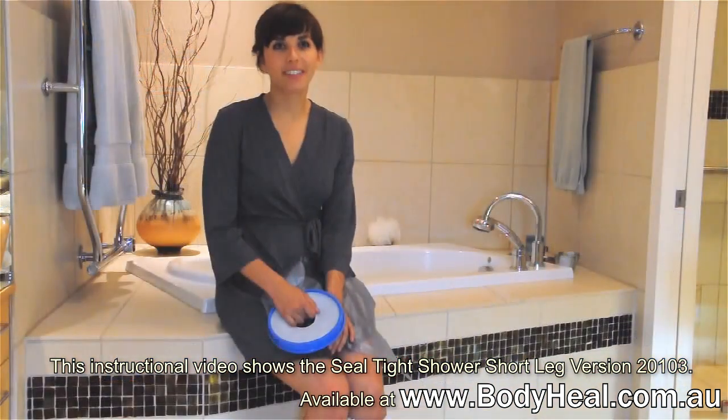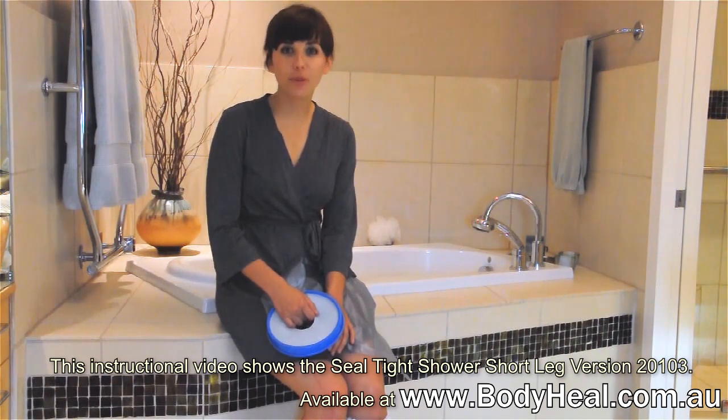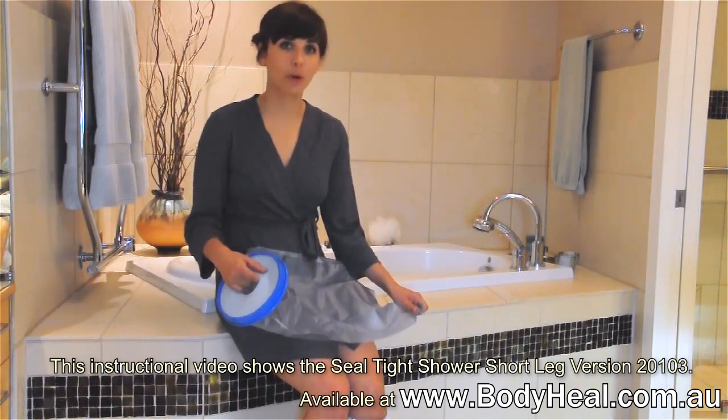Used properly, your Sealtight Original will last the life of your cast or dressing, help prevent infection, and remove the need for costly cast replacement. Always check with your doctor to be sure bathing is appropriate in your situation, and enjoy your Sealtight Original.